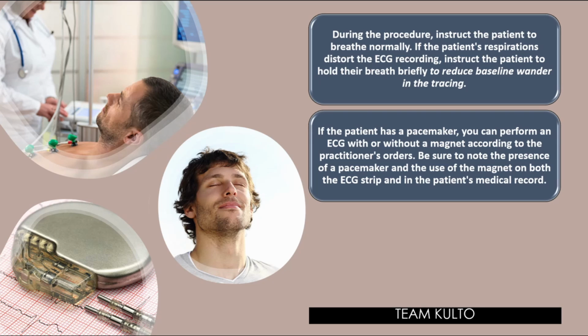Ganun din sa ECG mo, pag gagawa ka ng ECG sa mga pasyenteng may pacemaker, kasi ang pacemaker natin usually that is a metal made. So ayaw mo yung mag-alter ng effects. So, ang gagawin mo, you just have to take note of it and verify that with your doctor's order.